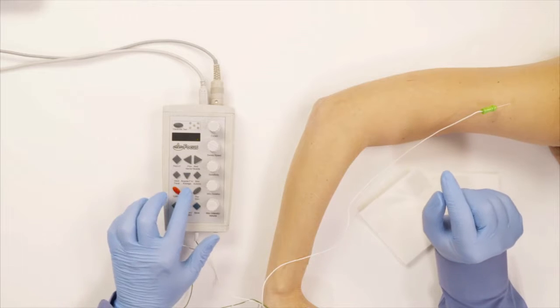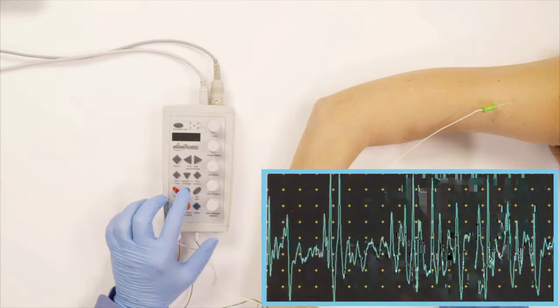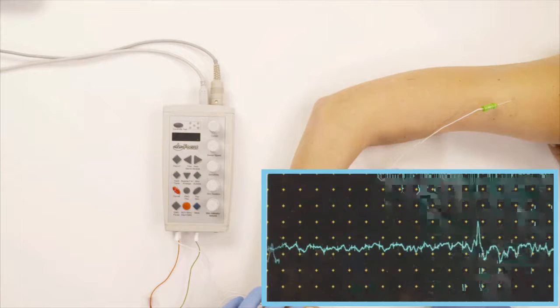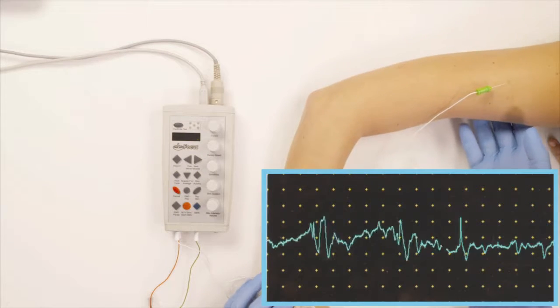And the first thing I'm gonna do of course is gonna be insertional activity and she's not relaxed right now so I relax the muscle a little bit.